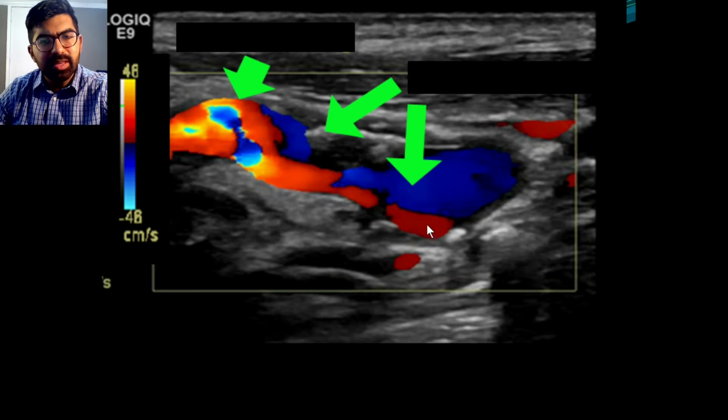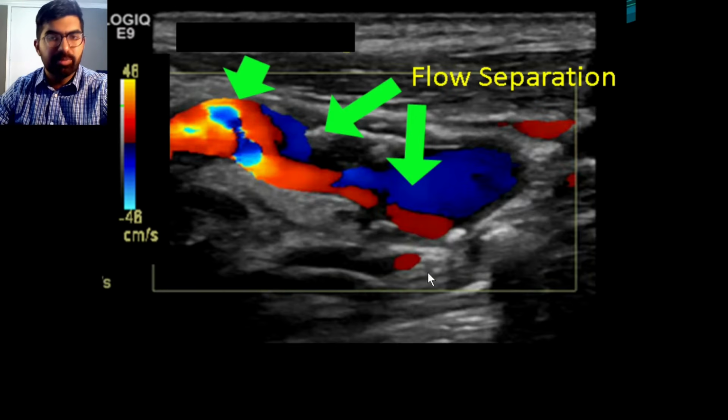But you notice something in between those. You see a dark black line. Now, where else do you see that dark black line? Well, right here. So this concept, when it flips like this, is flow separation. Okay, it's representing the change in the direction of the flow, even though we know, or we can imagine, that the blood flow is going in this direction, but this is what it visually appears on the ultrasound.